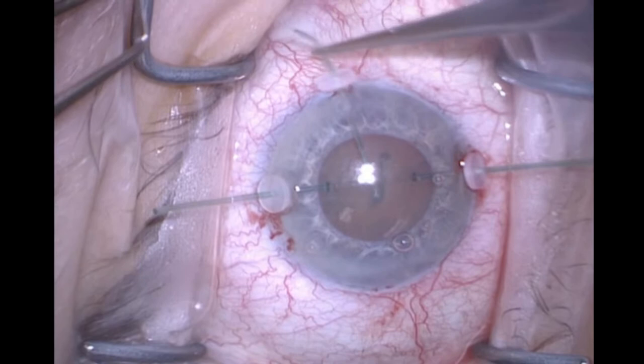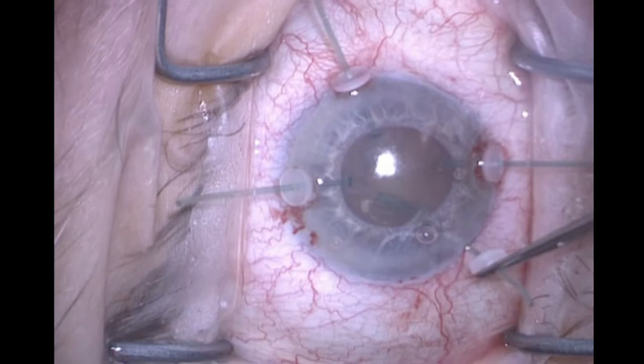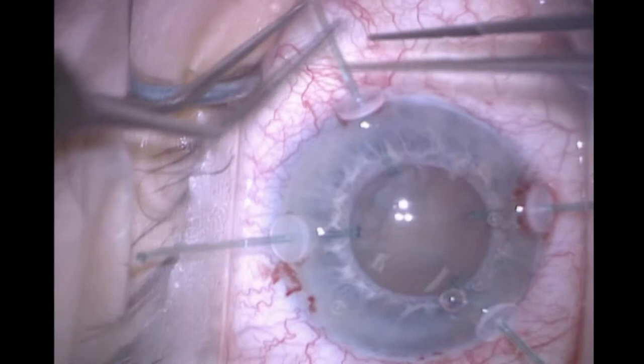You can see that they are double-armed, so there is a loop at the tip so it won't perforate through the capsular fornix. But the loop is tighter so that it's harder for a CTR to inadvertently pass through the open loop.